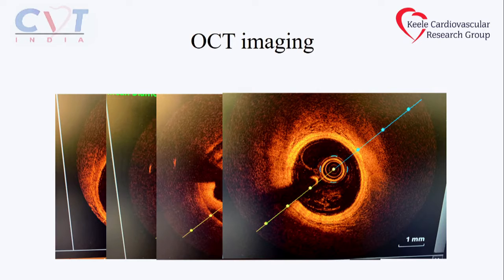So you've got a type A lesion. If you stent that, you've made a young patient who doesn't need a PCI have a stent. You probably toothpaste the hematoma and end up chasing it. So the correct treatment here, do nothing. If he's got ongoing pain or the flow is compromised, use a cutting balloon to release the hematoma.